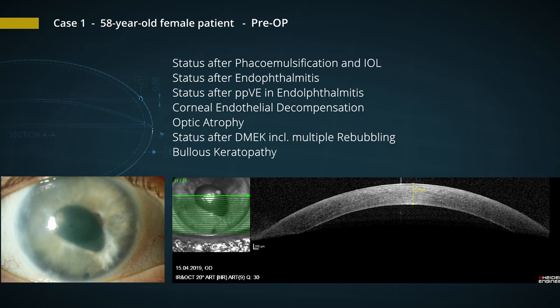Let's look at our first patient where we implanted this kind of implant. The first case was a 58-year-old patient whose right eye has undergone several procedures. In the OCT of the cornea, we see a thickness of 730 microns. Let's have a look at the video of the implant procedure.